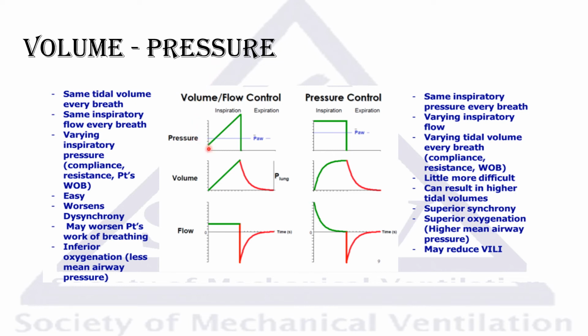Again, this is a graph, the airway pressure in green, tidal volume, the flow difference between the constant flow and the volume control versus the decelerating one. And with all honesty, you can achieve your goals with either mode. But if you notice here, there's a line here in the airway pressure. So pressure control usually gives you higher mean airway pressure versus volume controlled.